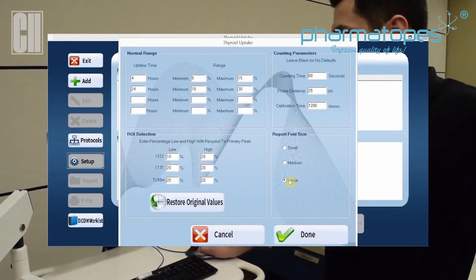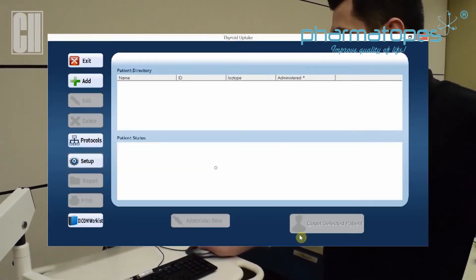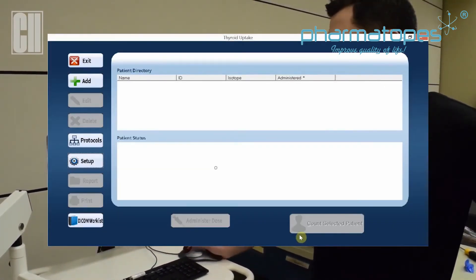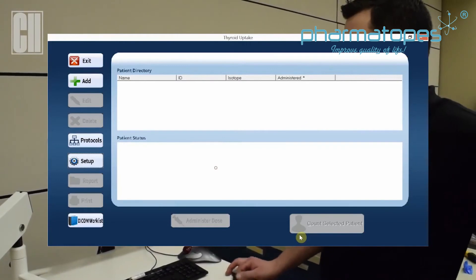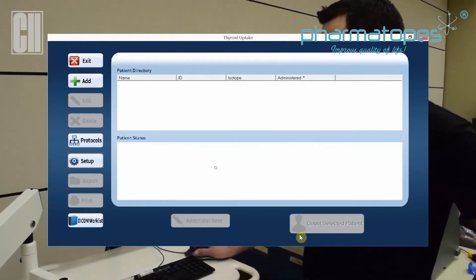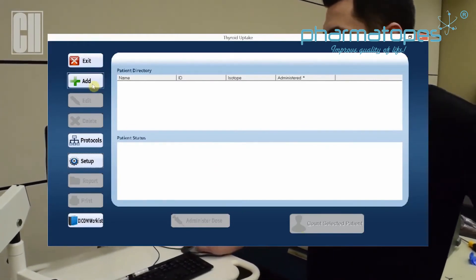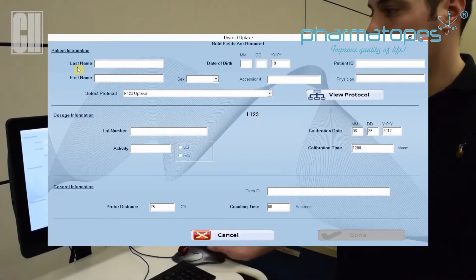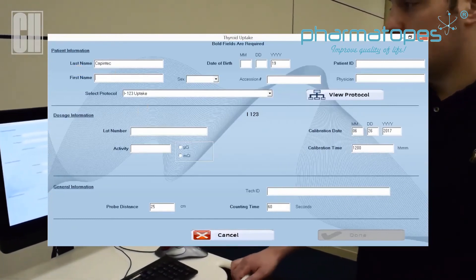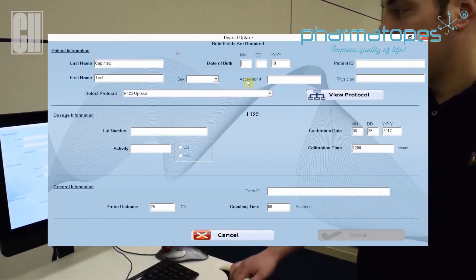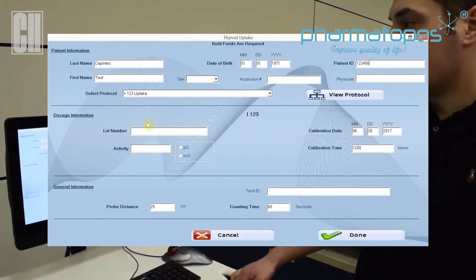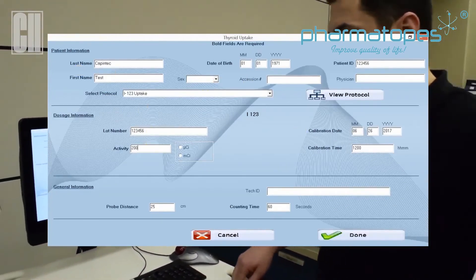Click on Done. Now we can add the patients for the study. To add a patient, click on the Add button. We're going to enter in all the fields in bold. A few of the fields aren't required, but we're going to fill in the complete information.